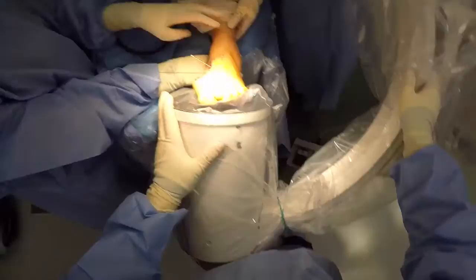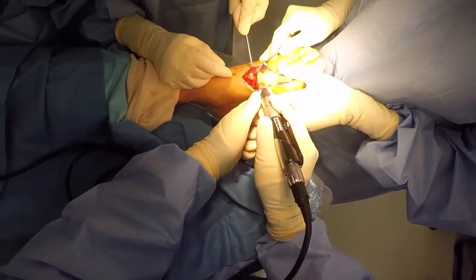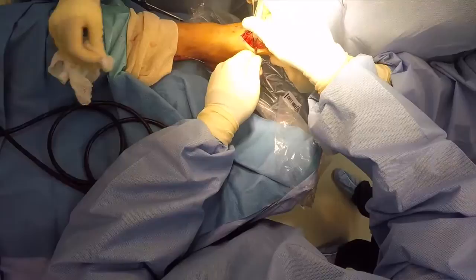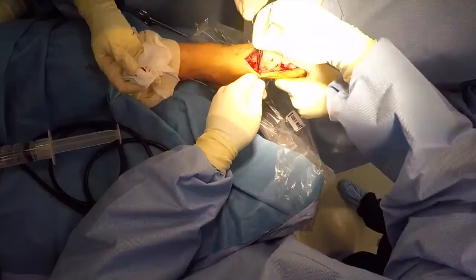Our C-arm has arrived from the adjacent OR. So we take a look at our provisional fixation, and we've determined here that we need to obtain a little bit of additional correction. So here we are increasing the size of the wedge cut from the medial cuneiform with the base lateral. And here we are teasing that fragment out, utilizing sharp and blunt dissection.